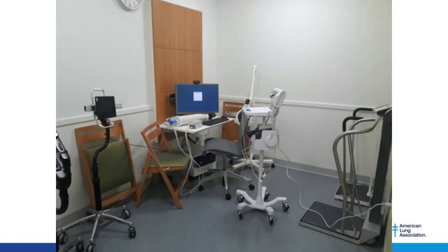This is a typical place. This is where we do intake in primary care. I have taught spirometry courses for many, many years, and I've always taught them to just make it another vital sign. In other words, there's a blood pressure cuff here, as you can see, the height and weight device here. We're measuring people's temperature. And I used to always tell my attendees of my spirometry courses, if they're coming for a respiratory problem, asthma or COPD, you just do the spirometry right there where you do the intake.